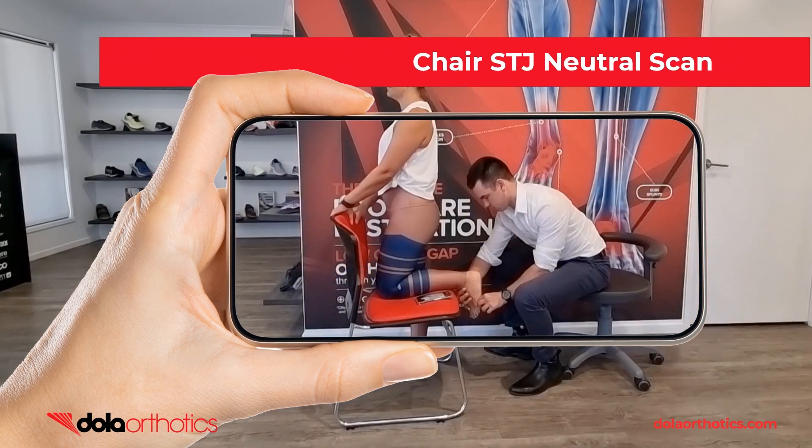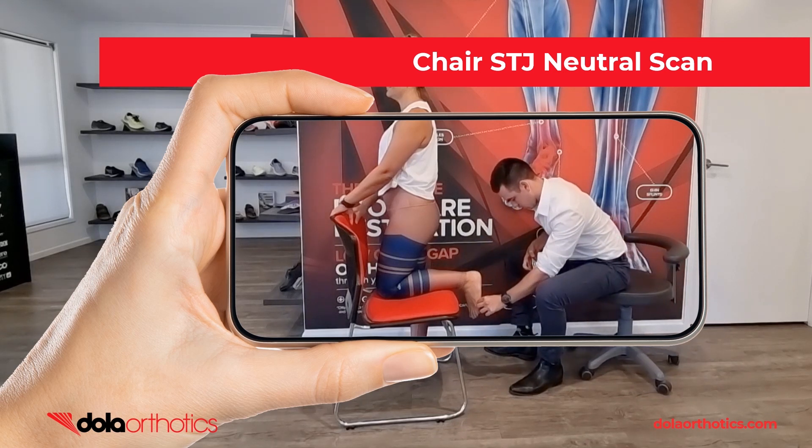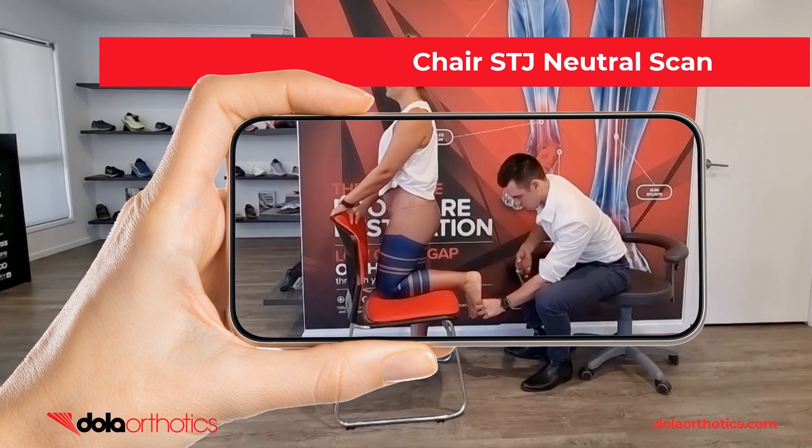Here is a demonstration of the iPhone being used to scan the foot using a chair for patient positioning. This position is often seen in challenging environments including home visits, consulting rooms, sporting or gym settings or mobile clinics. The clinician is able to hold the foot in subtalar joint neutral just like completing a traditional prone plaster cast. Move the phone to capture all aspects of the foot including the heel and assess prior to submission.